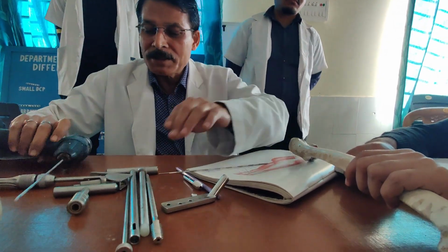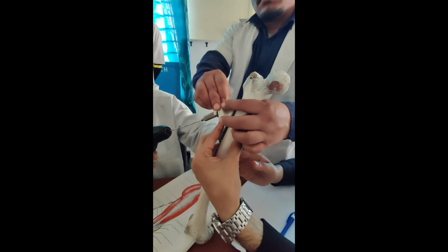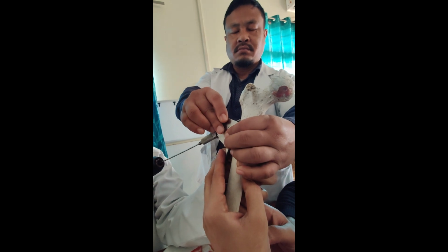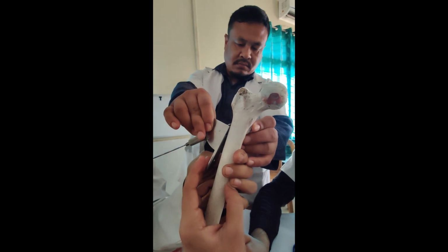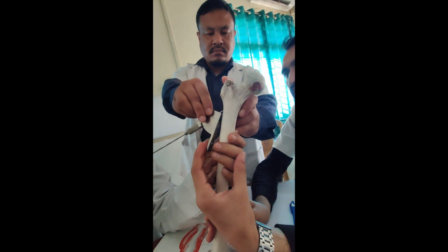So next, you put it there. In this area, two things can be done. Be careful about anteversion. If you think your anteversion is not corrected, anteversion corrections can be done intraoperatively if you make the limb internally rotated.